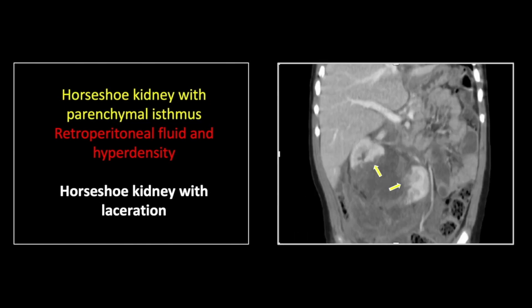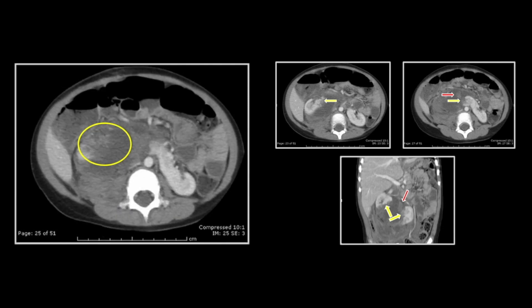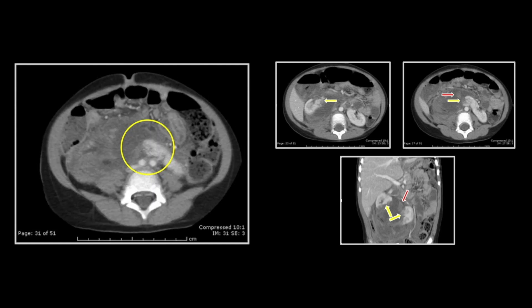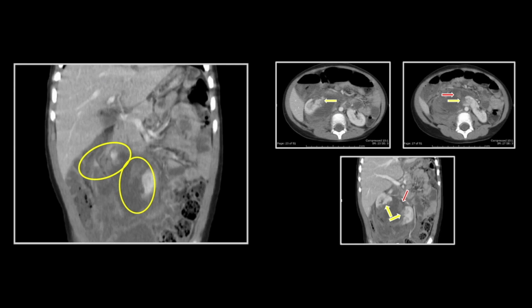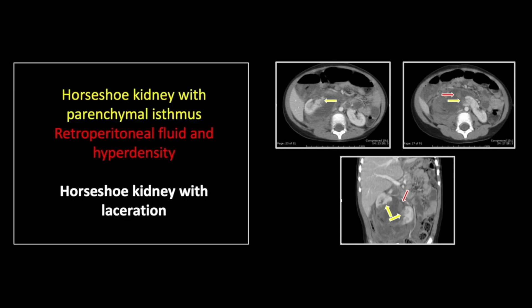This is probably better appreciated on the coronal, where you see the irregular sheared aspects of that parenchymal isthmus and a large internephric fluid collection with clot. There is that sheared surface of the inferior right kidney and that of the left — note again that blush of density along those irregular surfaces. So that is a horseshoe kidney with laceration of its parenchymal isthmus.